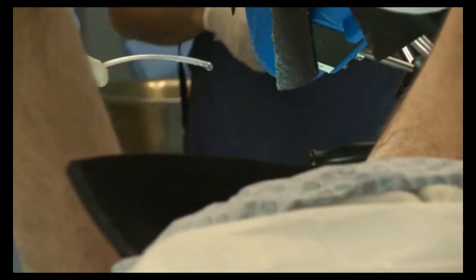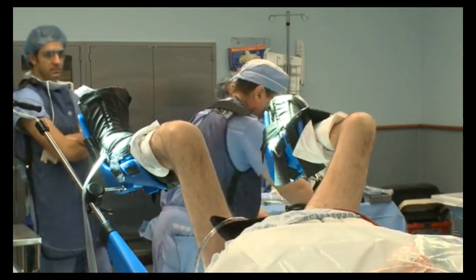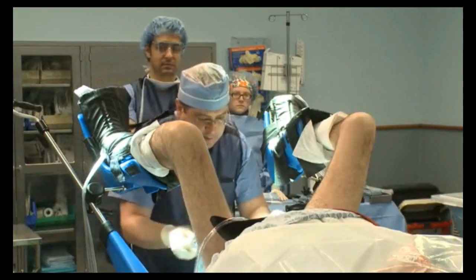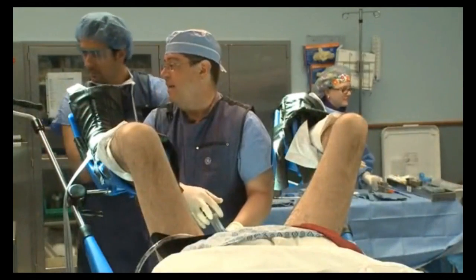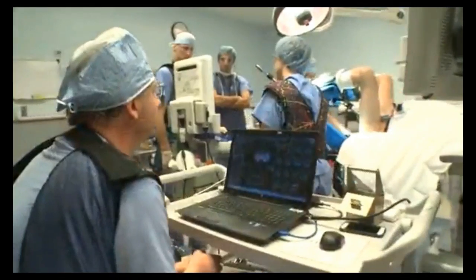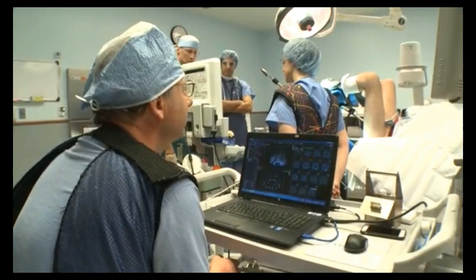Just getting all my pieces and parts together. That's why this product was so good for him — he's just not going to have any space between the prostate. You can see it does not have hardly anything for fat between. There's my Foley. There's my base. Looks like we're pretty close.